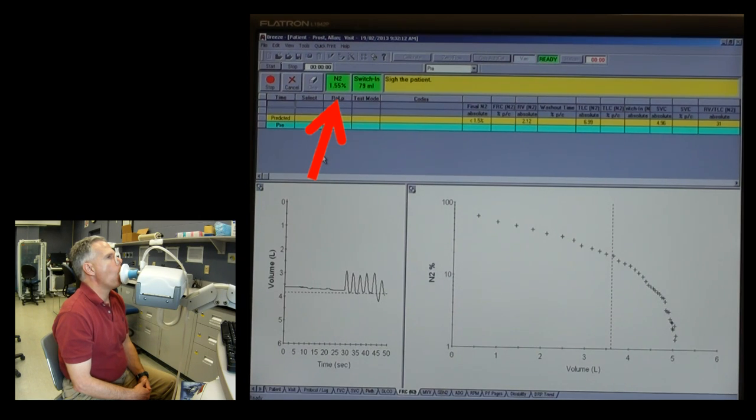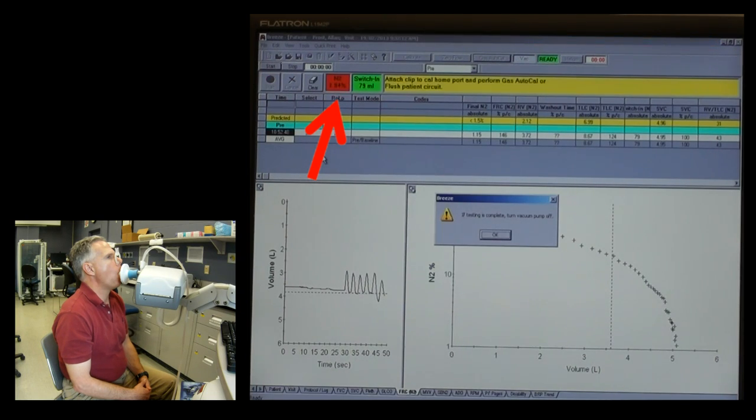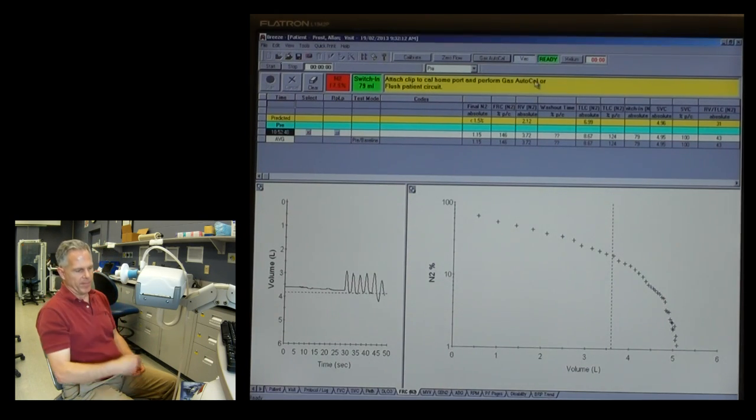Okay, just a couple more breaths. And this machine is actually going to coach us to do a sigh, so get the patient to do a little sigh breath there, and that's the end of the test. Okay, that's a nitrogen washout test.